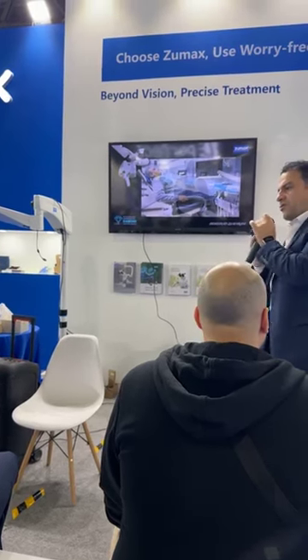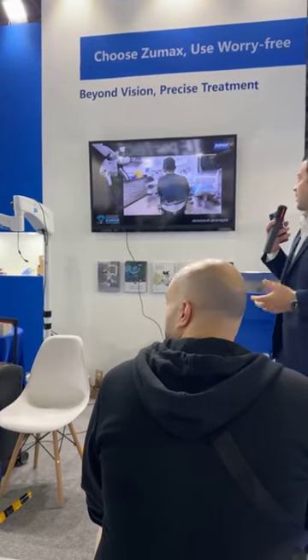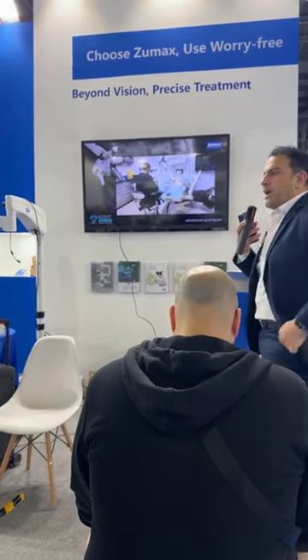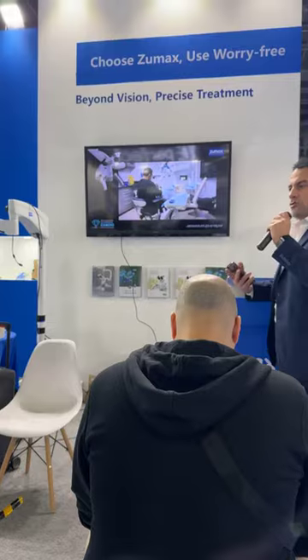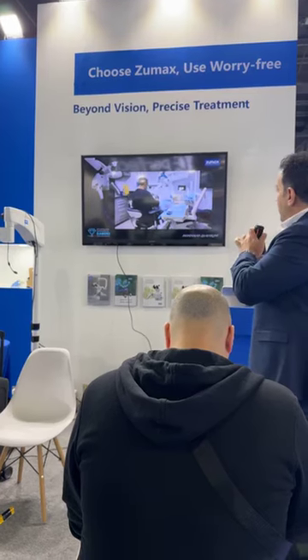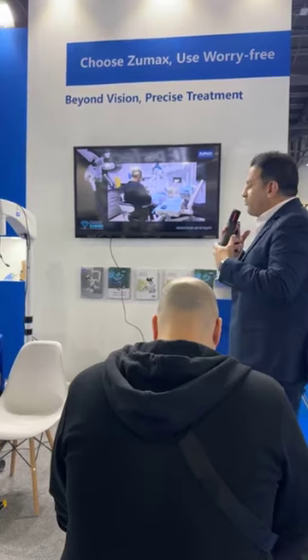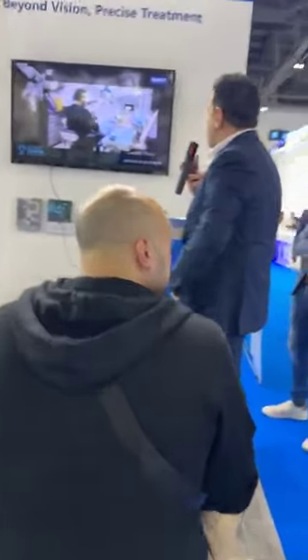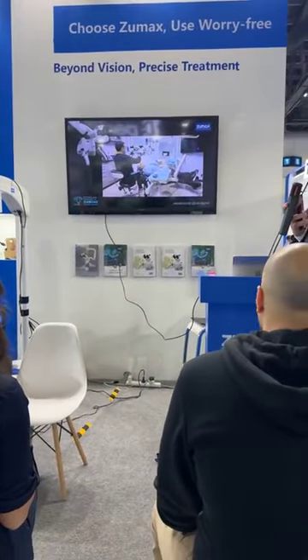And don't jump directly to the microscope when you talk to the patient or do the examination. Do the clinical examination first without any sort of magnification, so you have a wide, general image of the patient's health. Then, when it comes to examination with the microscope, I would love to sit in a position from 9 to 11, not 12, where at 10 I can evaluate each aspect.